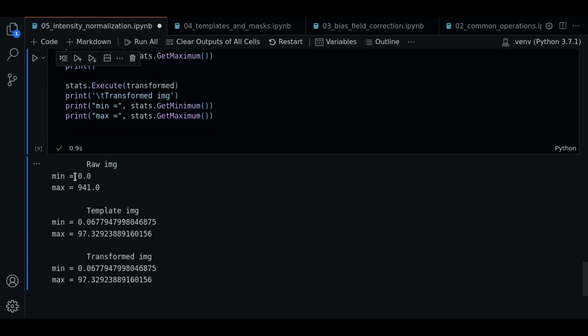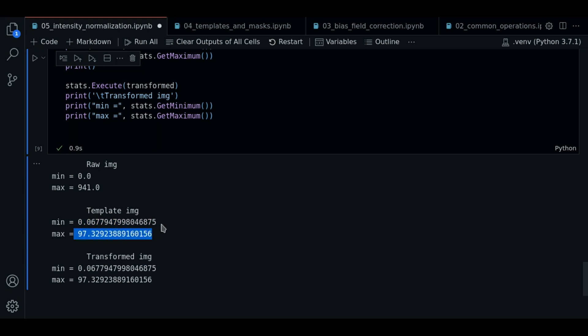So now as you can see, the raw image has this min value of zero and max value of 941. For the template image, we have the following value and 97 for the max value.